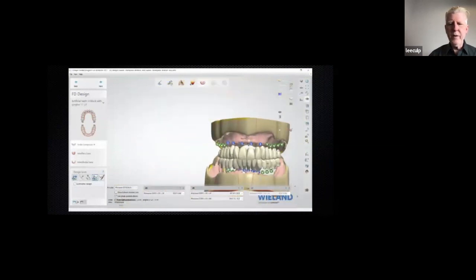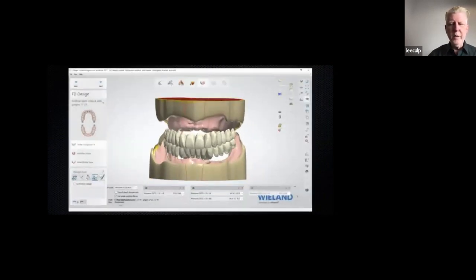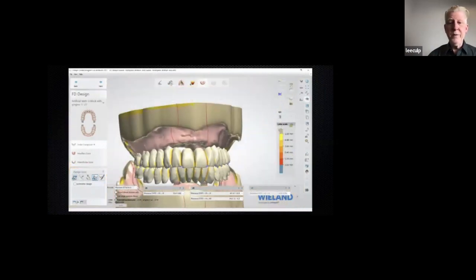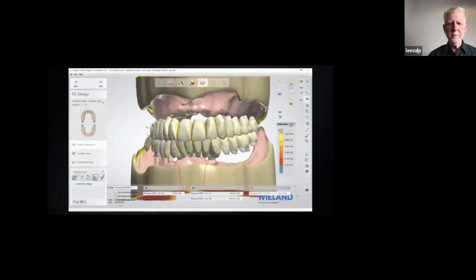So on the anteriors, I can rotate, I can tilt, I can make them longer. Basically anything aesthetically that you would like to see, we can do. And then the fun part with this is if you did have a face scan, then you're looking at different ways to do your teeth, different shapes, different inclinations, and the patient can look at them and see exactly what you're doing before you ever produce the denture.